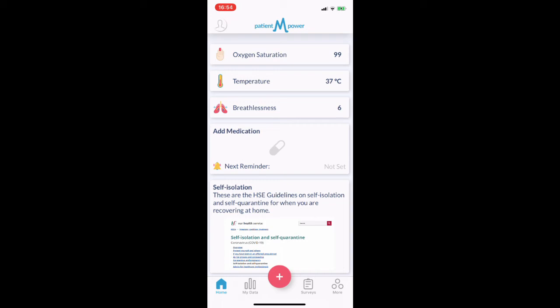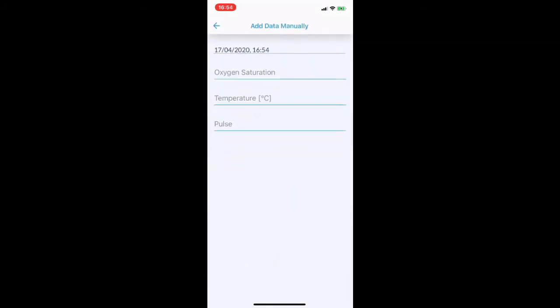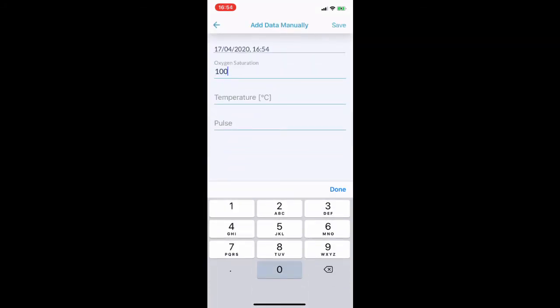When you have the reading and you are ready to enter it, press the plus button and add data manually. Type in your oxygen saturation readings. Here is also where you will record your temperature.